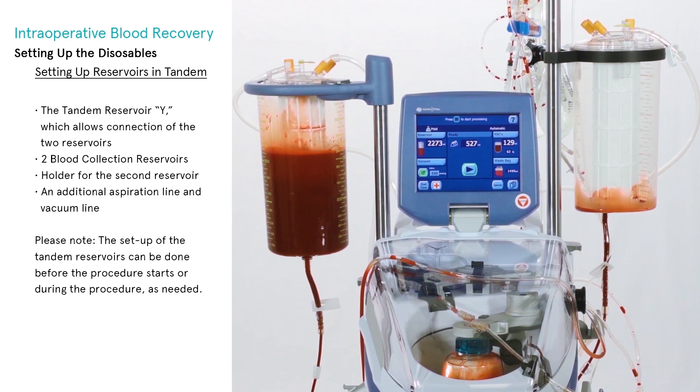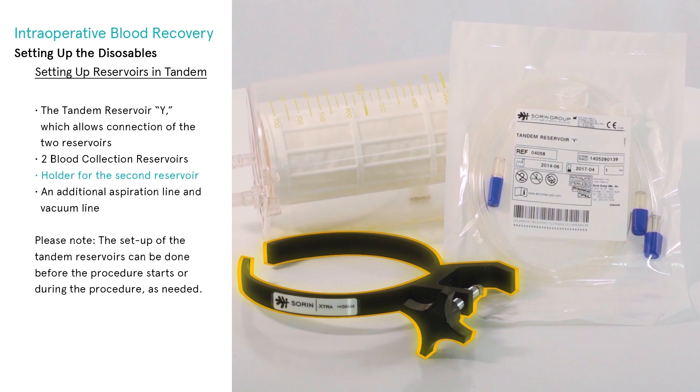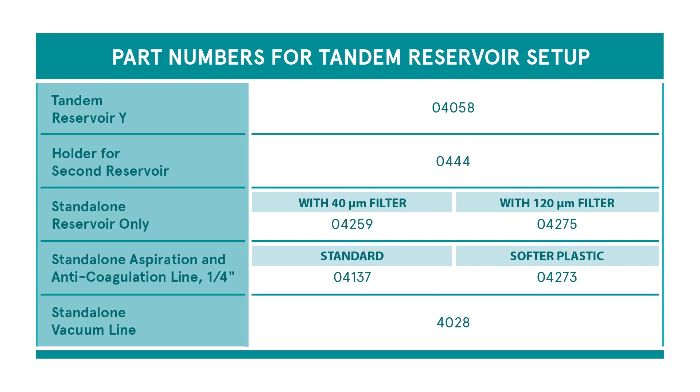There are times when blood loss warrants the use of more than one reservoir, such as in a transplant or trauma resulting in catastrophic hemorrhage. To set up reservoirs in tandem, you will need the disposables already set up, plus the following additional components: the tandem reservoir Y connector (which allows connection of the two reservoirs), two blood collection reservoirs, a holder for the second reservoir, and an additional aspiration line and vacuum line.